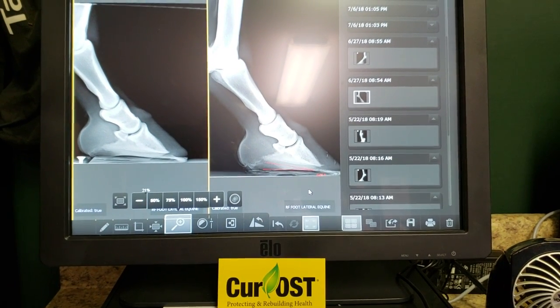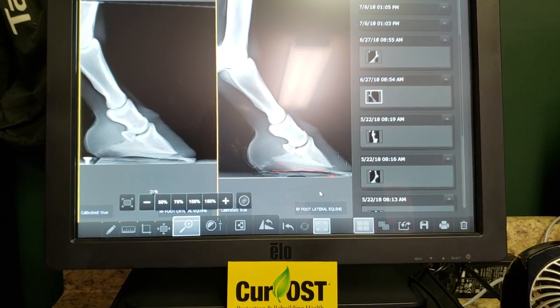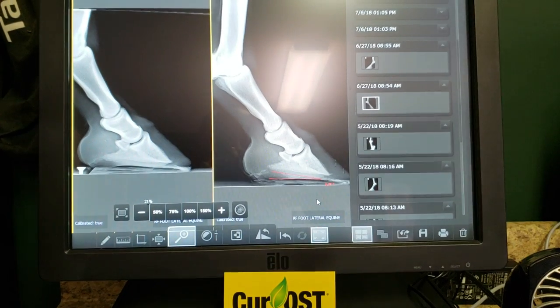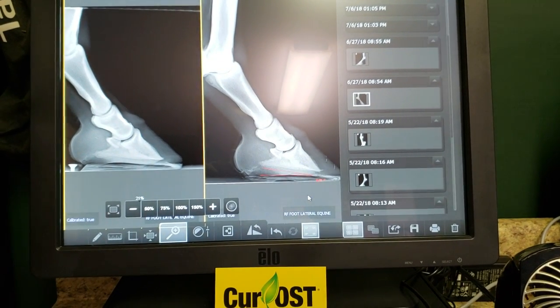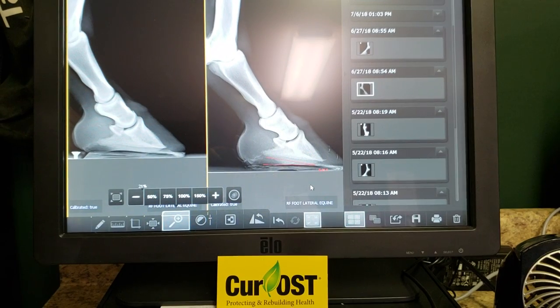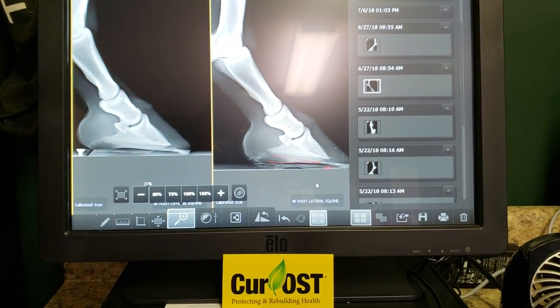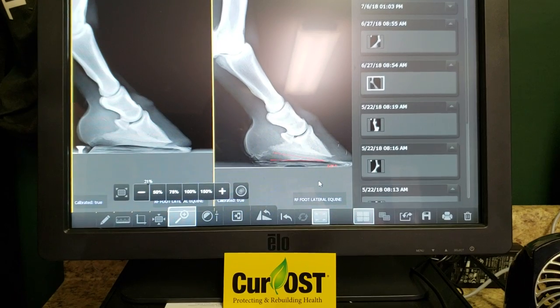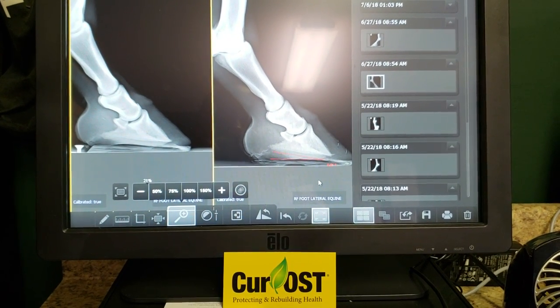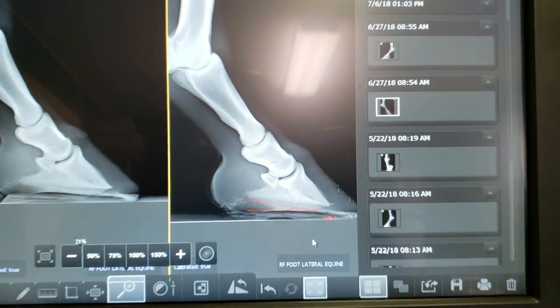Looking in front of us, we've got two x-rays. The one on the right is his right fore, taken in June. The one on the left is an x-ray taken from September. This guy came to us fully shod — wedge shoes, clips, pads, silicone. His feet were actually in pretty bad shape: a lot of thrush, dead sole. The heels were broken down and had to be cut and removed with a paring knife to help stimulate new growth. Here on the right-hand side, we have his initial x-ray.